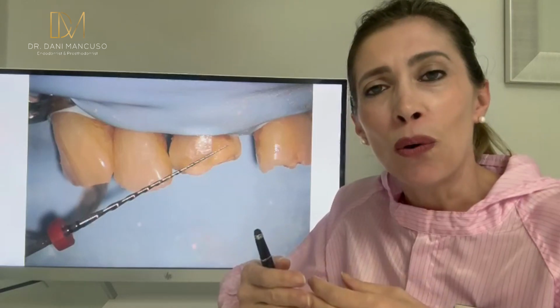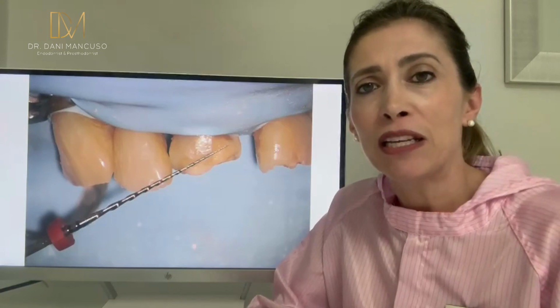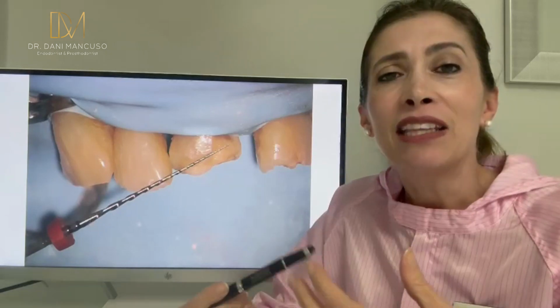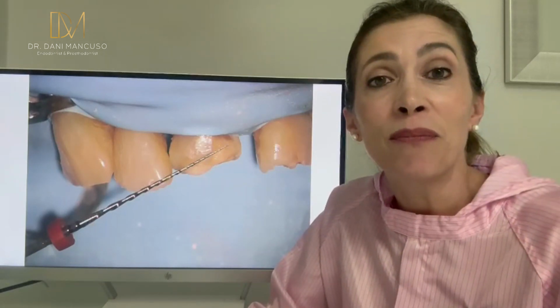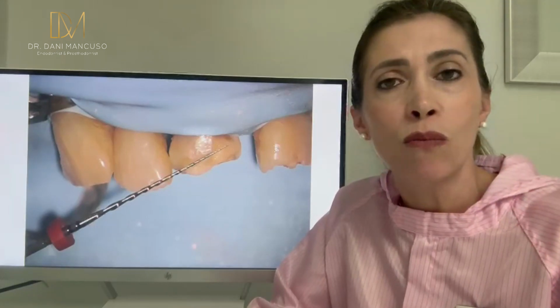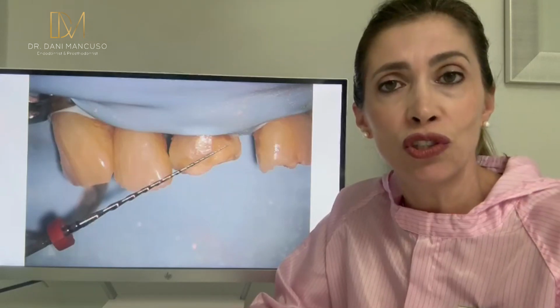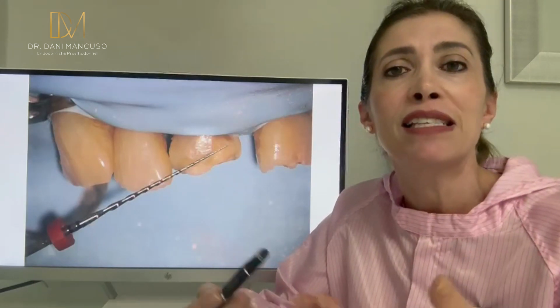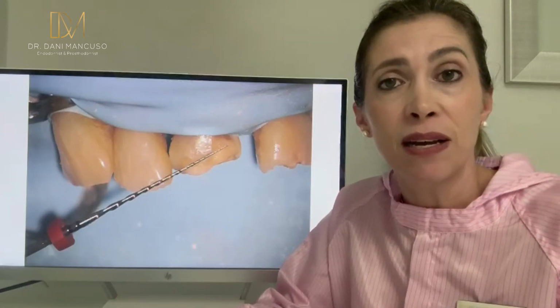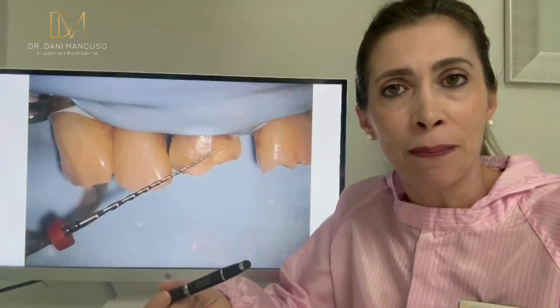It's important to know that you can mix and match systems. So I was planning to use the Trunatomy, but I wanted to use a different glider, and the glider I chose was the R-Pilot. Can I use the glider from the Trunatomy? Of course I can. It's a wonderful file as well, but I wanted to show you that you can use different systems and combine them. You don't need to use just a single system and finish with the GP of that system. You can mix them if you want to.